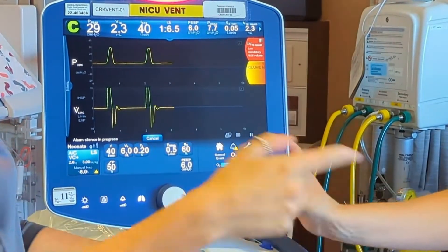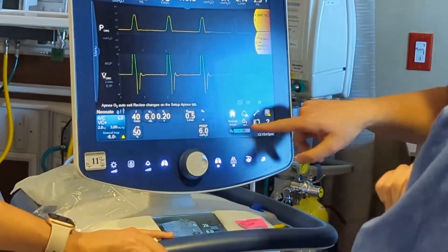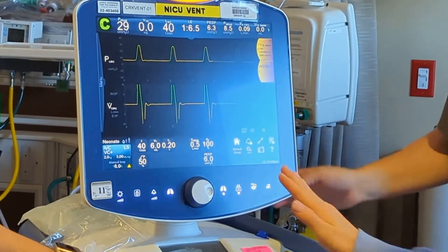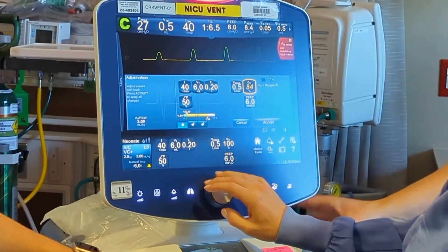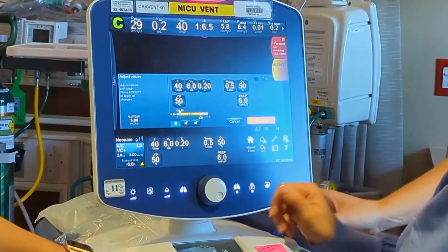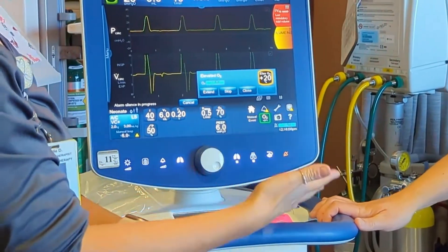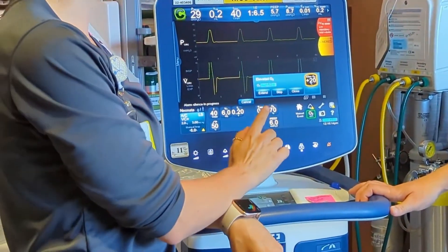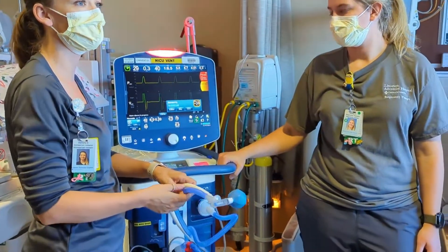You can also extend the oxygen increase if the baby needs more, or stop it if they've recovered in time. If you're having to continuously press this button, we need to let the physician know — maybe we need a chest x-ray. We need to determine the reasoning: why are their oxygen needs increasing?